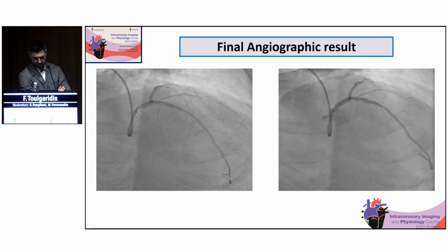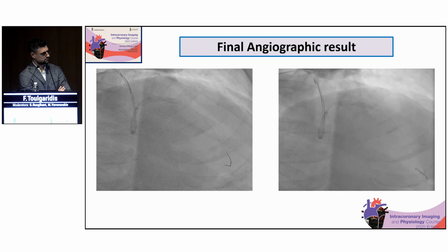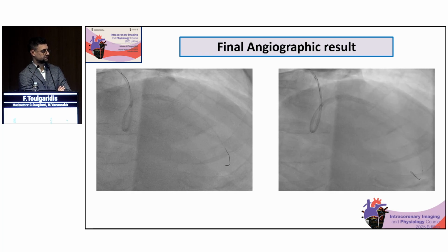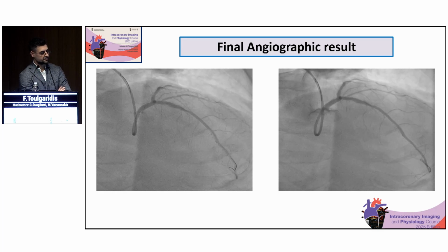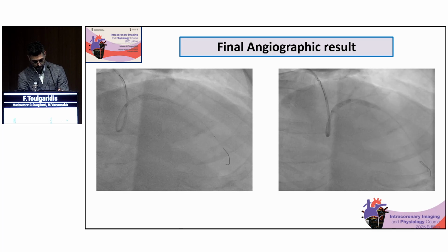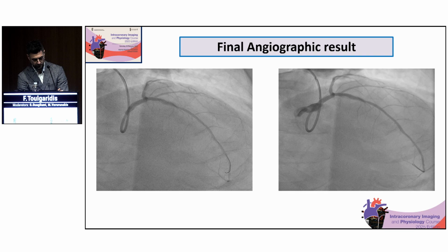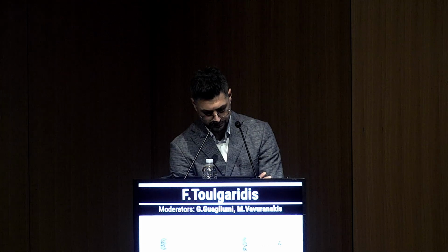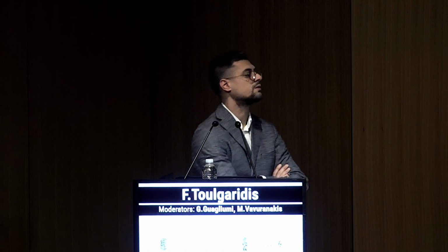I would do another run after the balloon to see the cracks, of course, and I would do a run in the circumflex after the procedure, after the POT balloon, to see how is the ostium. That's a point. But anyone would do a kissing to maintain entrance to the circumflex? Yeah, usually end with a kissing. I think that if the result after POT is satisfactory, kissing is not mandatory.